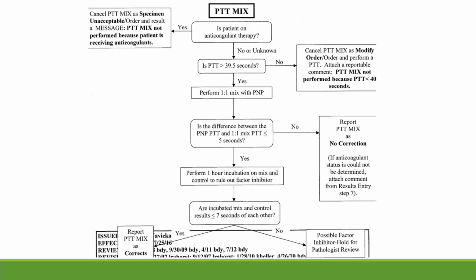We're going to incubate it for 1 hour to rule out a factor inhibitor, because remember, factor inhibitors are very, very dependent upon temperature and time. And the longer we incubate them, the more time those inhibitors have to actually inhibit the factors that are present. So that is why we incubate it, even if we see an initial correction.